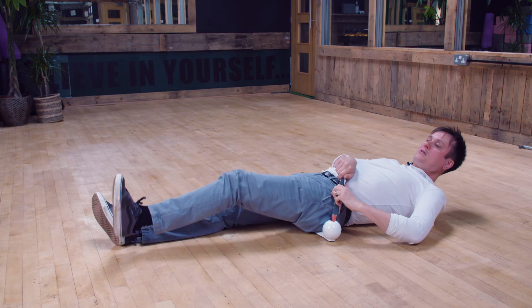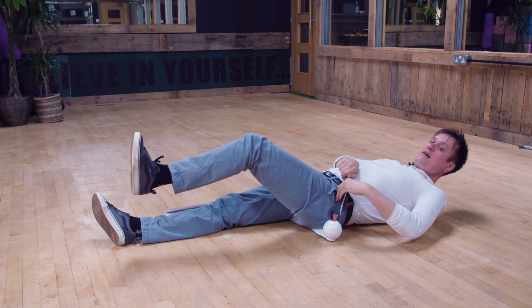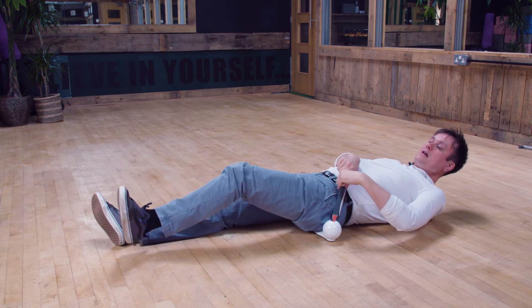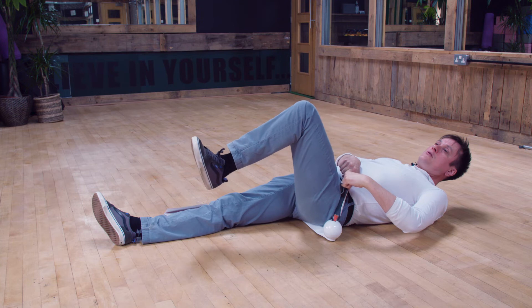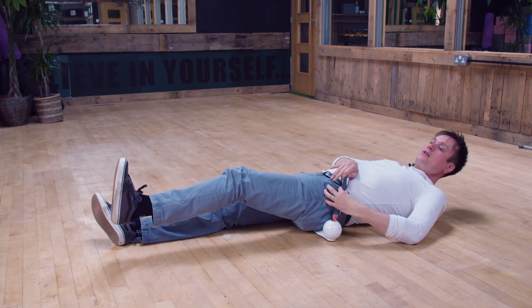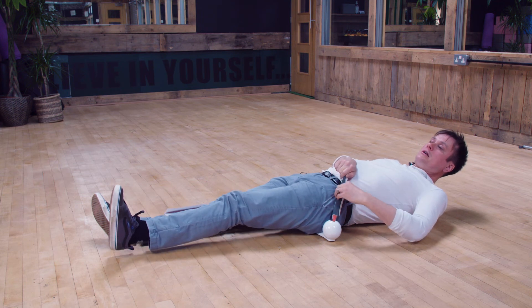Come up to 90, slowly lower down, and take about five seconds doing this. Finally, do it with your breath — as you come up, take a big breath in, and as you go down, five seconds, breathe out, pushing on the device. Don't let the heel go down on the floor.